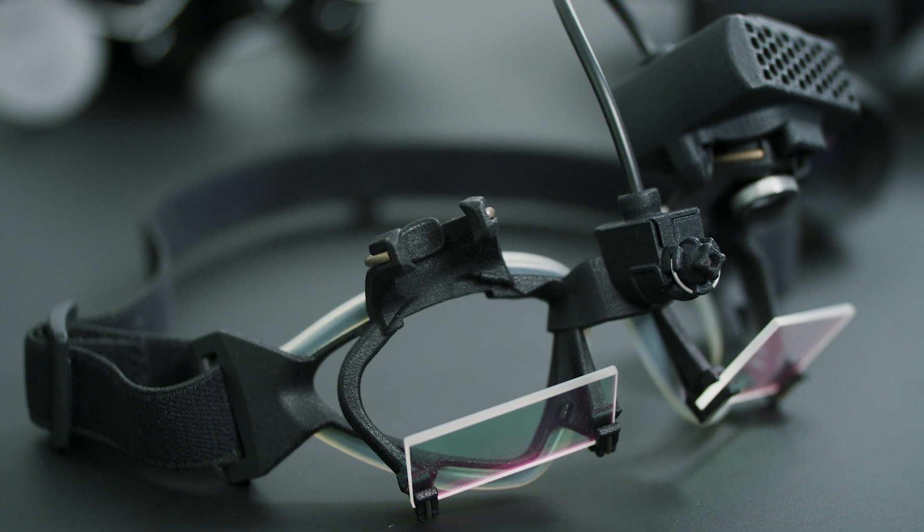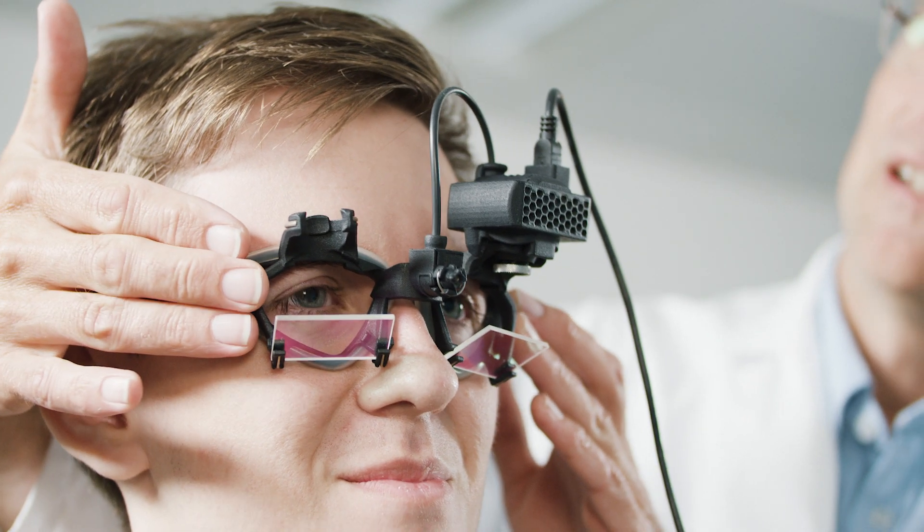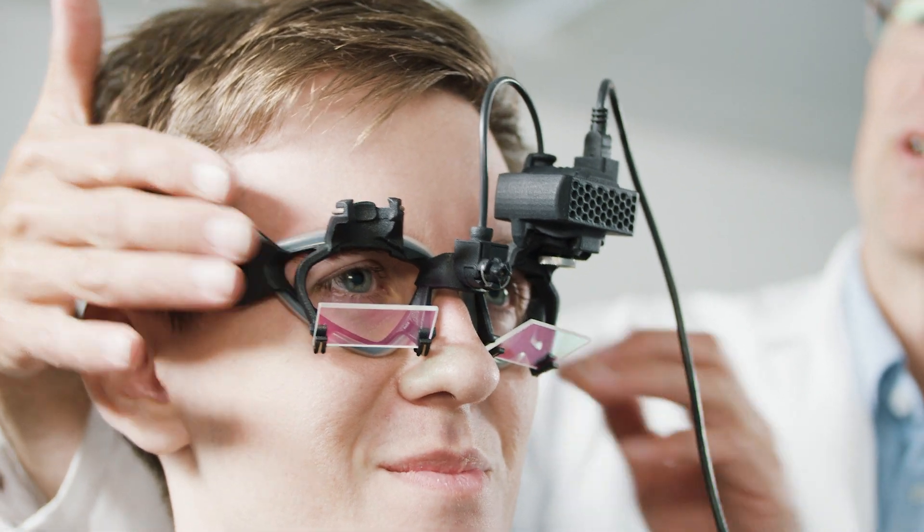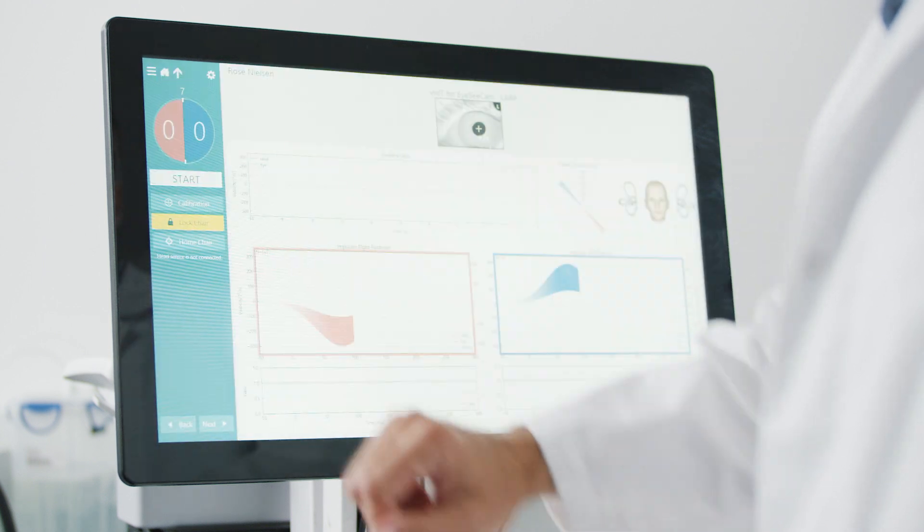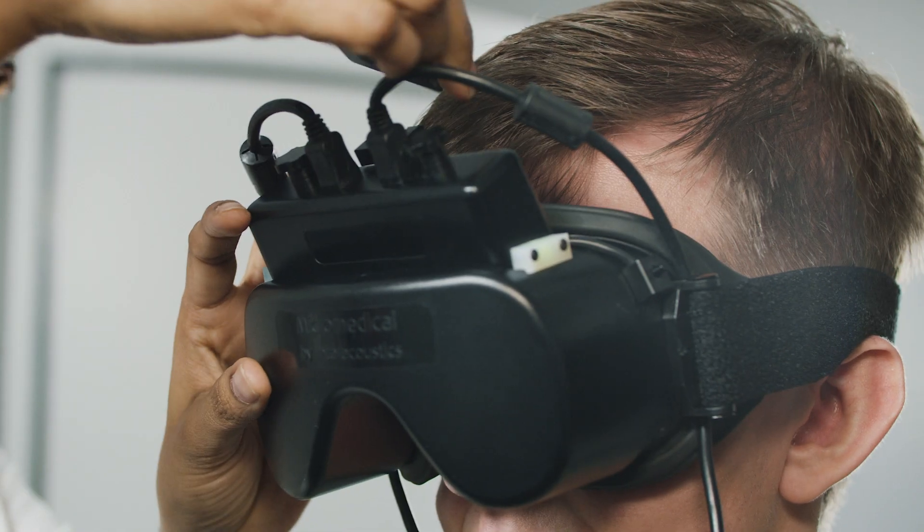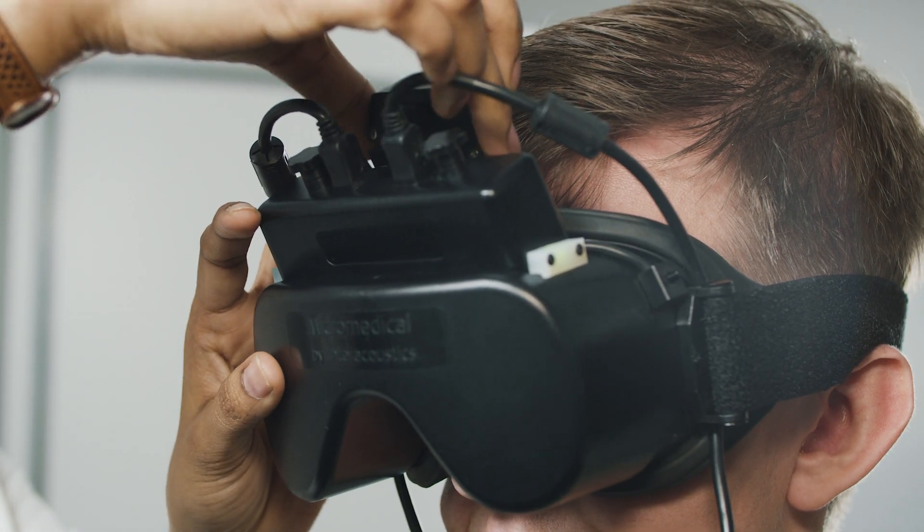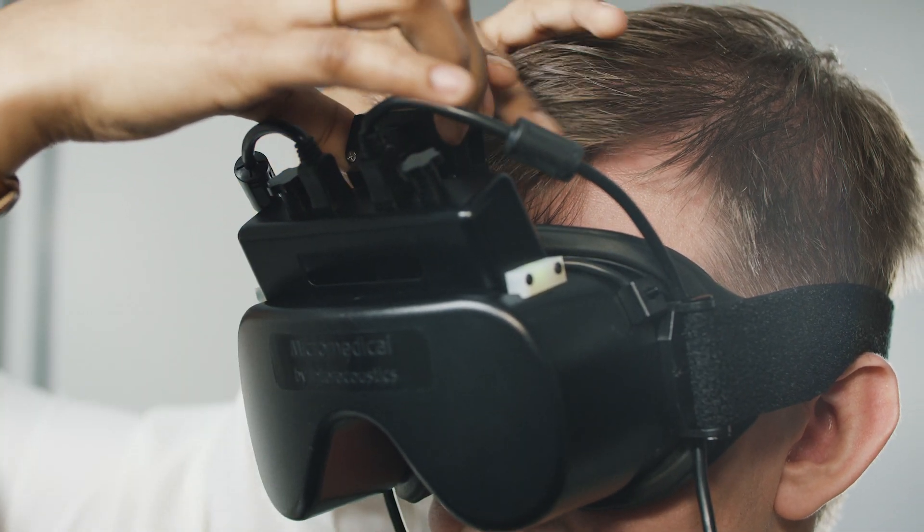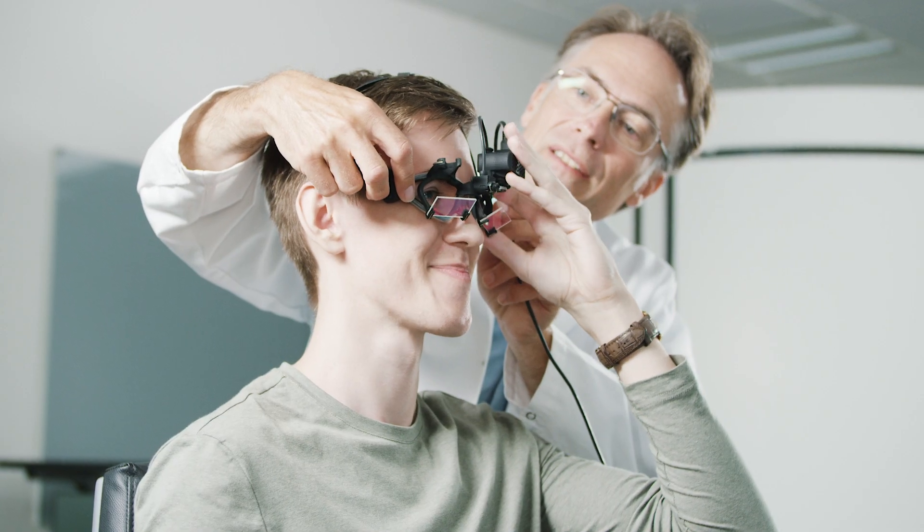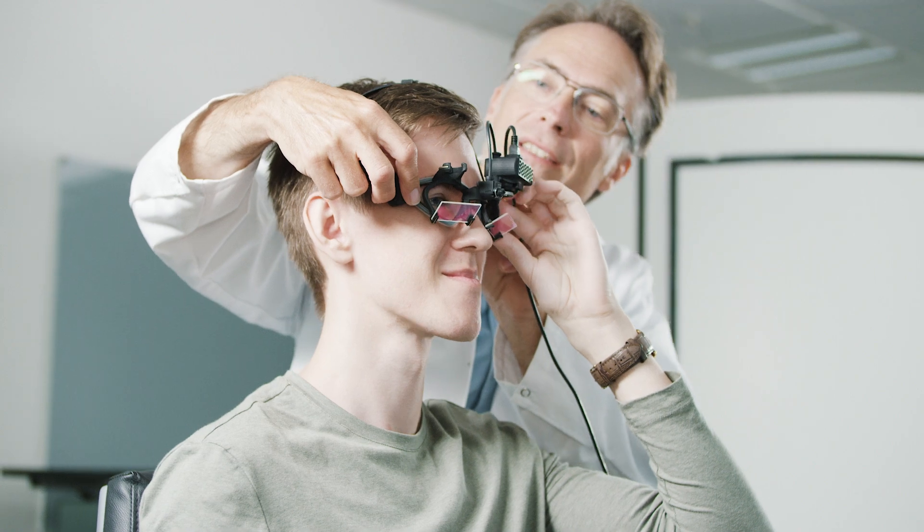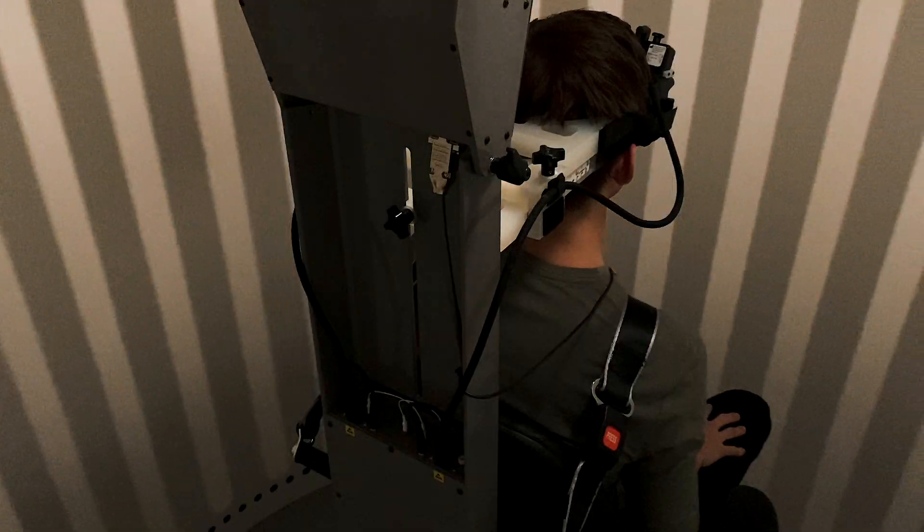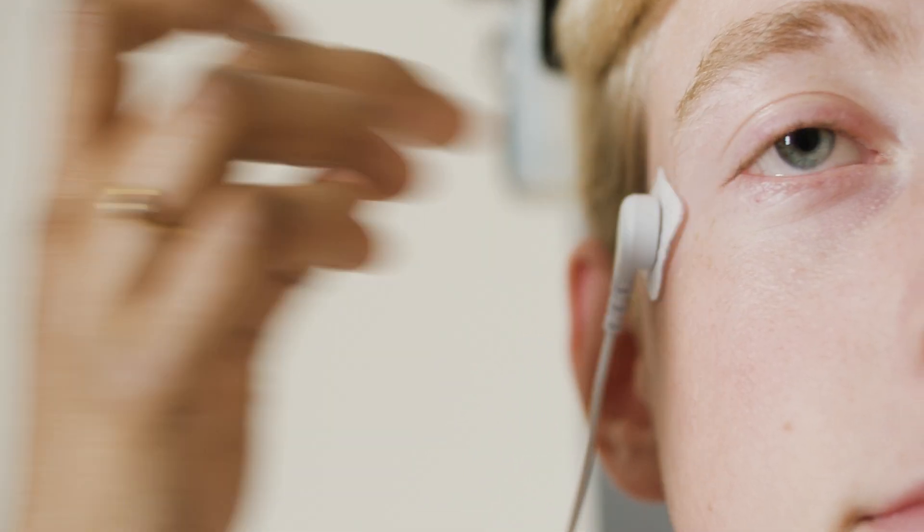With Visualize, every vestibular test is at your fingertips: video nystagmography, caloric, video head impulse testing, rotary chair testing, and electronystagmography.